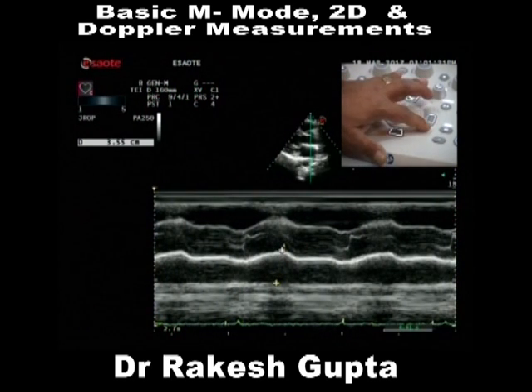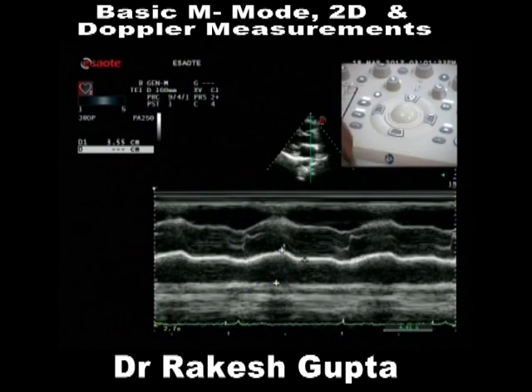What's the LA size now? 36. Third, I have to measure the aortic valve opening. So leading edge, now the question comes, where do I measure? Possibly this is an image which is 23 millimeters. So in the plax window: aorta, LA, AV cusp separation. First three measurements. Now let's save this image.